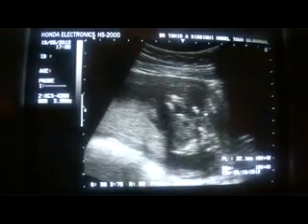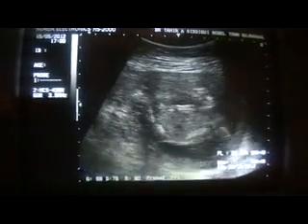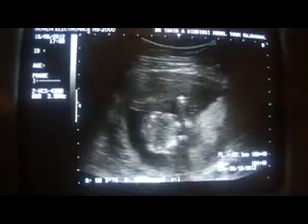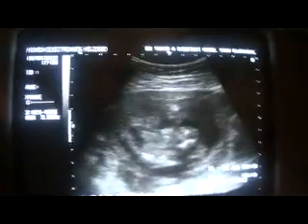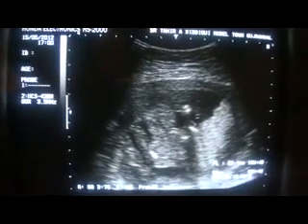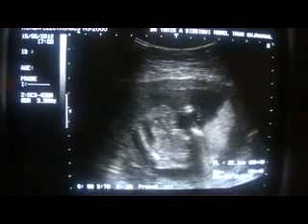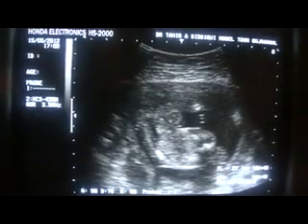So anencephaly is there, and this is a case of multiple pathologies. Anencephaly with OMPHALOCELE. This is the poor development of the vertebral column at this stage. This is the vertebral column, this one, this area. This is the leg.